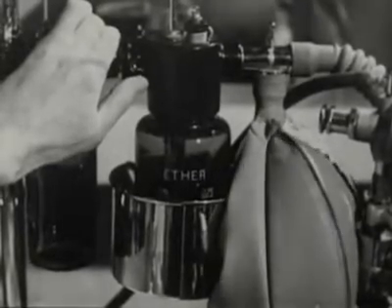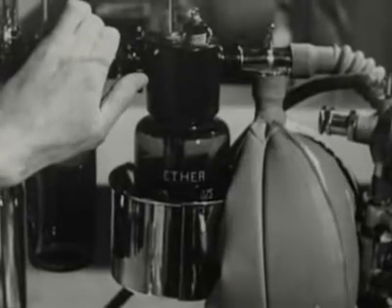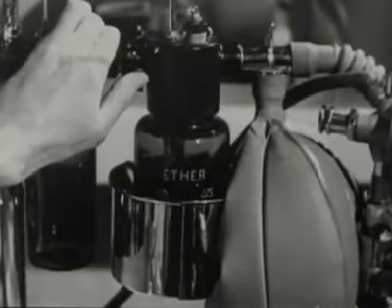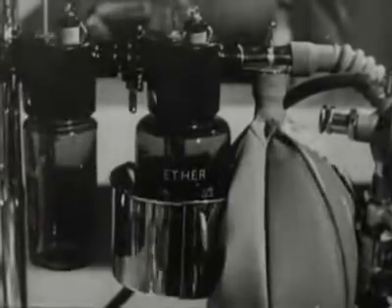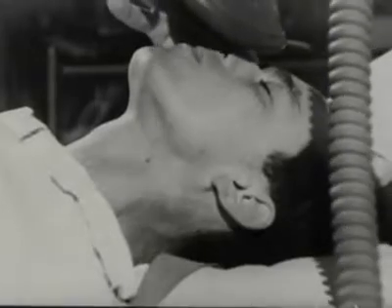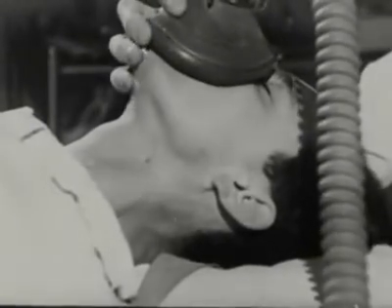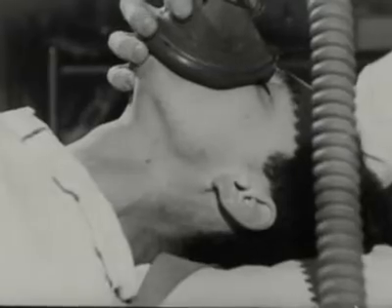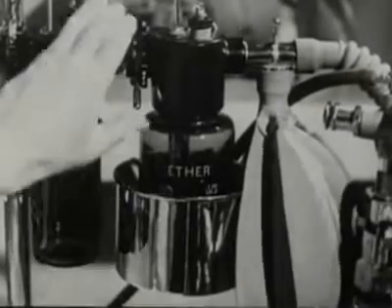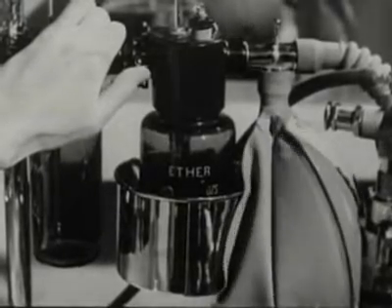If the regular rhythm of breathing is interrupted by swallowing or breath holding, which you can see on the bag as well as by looking at the patient, turn off the ether. Lift the mask until the ether vapor is washed out of the rebreathing system, and then replace it. When the breathing's regular again, you can turn on the ether, as before, a little every 3 breaths.